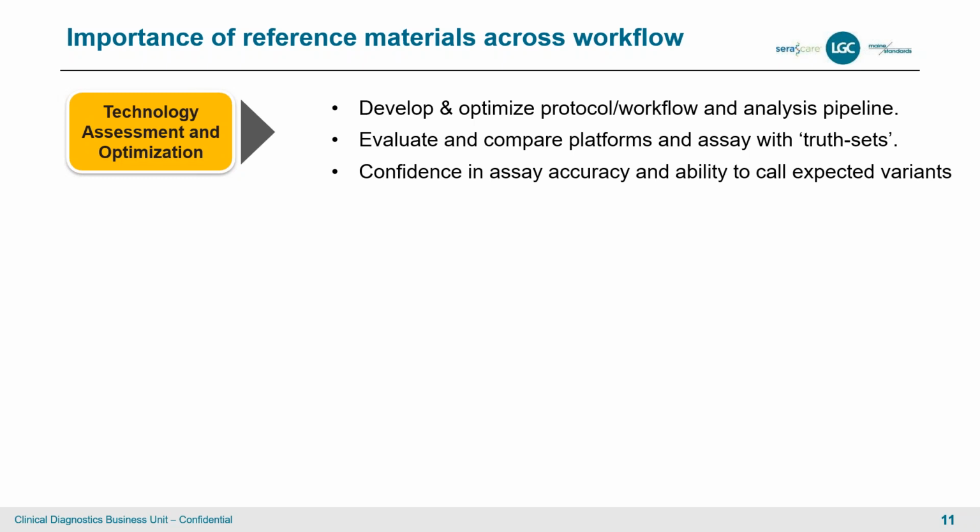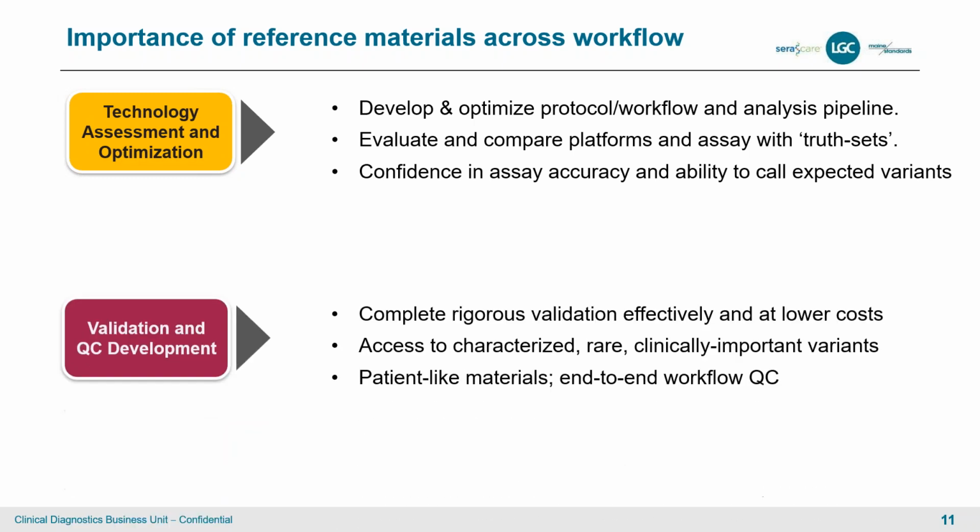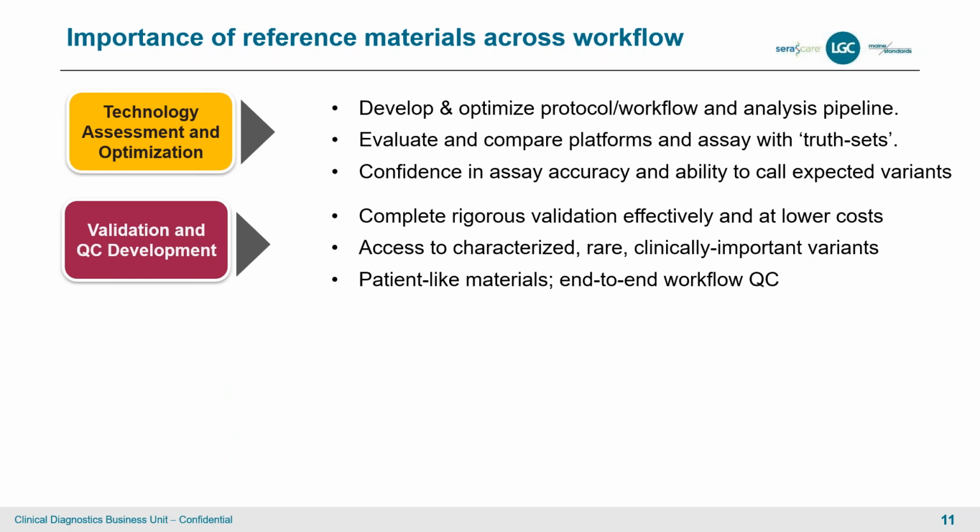Okay? So in this stage, you want to really get confidence in your assay accuracy and the ability to call the expected variants. Okay? So before you open up your lab for patient samples, you really have to know that you're producing the right result. Often that could take a few months to even a year.